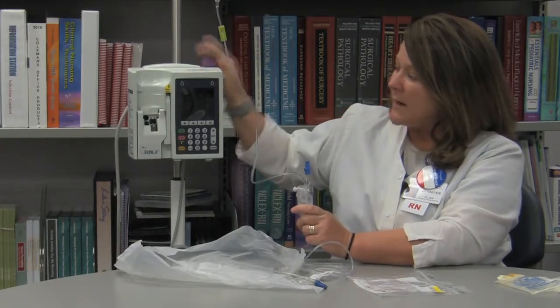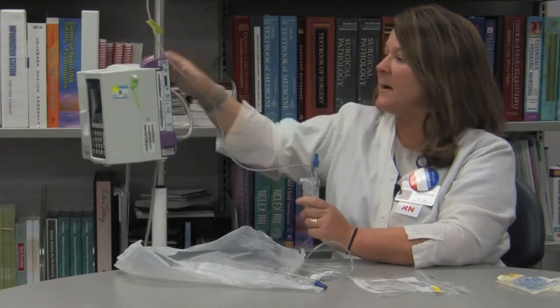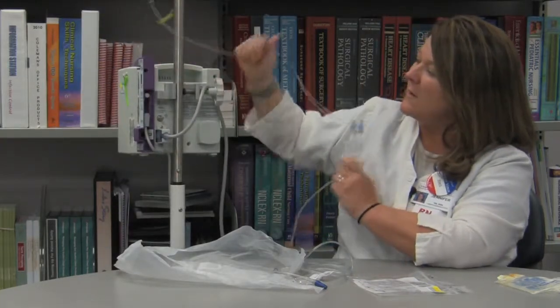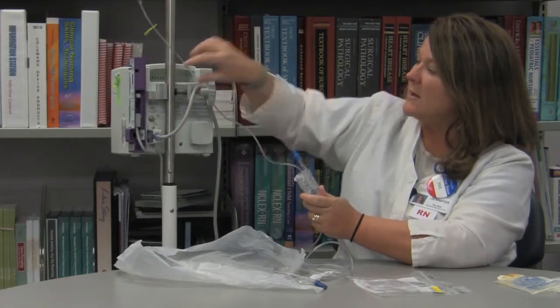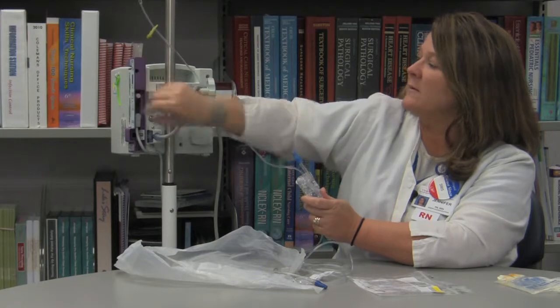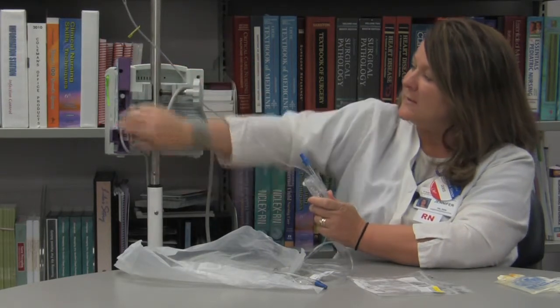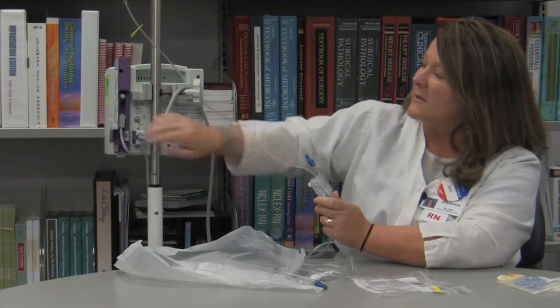Now, a little bit about our pumps. If you're looking at the back of the pump, there's a few features on the back that you might want to know. The top one is our volume knob, so you can adjust the volume up or down. There is a black toggle switch, which you may not be able to see, but when you're here at the facility, you can kind of look at the pumps a little bit.